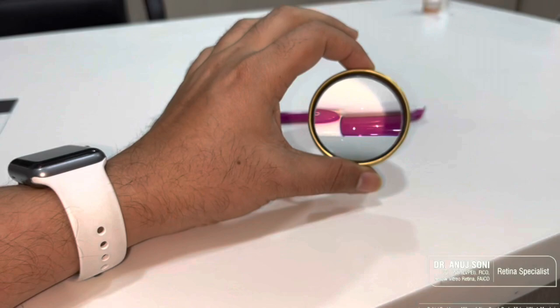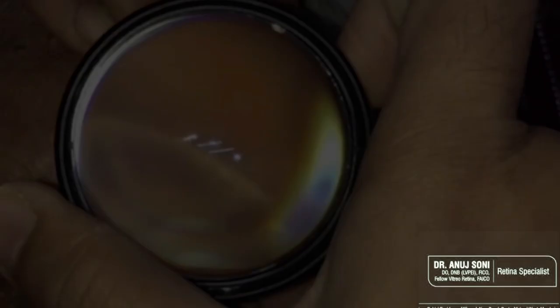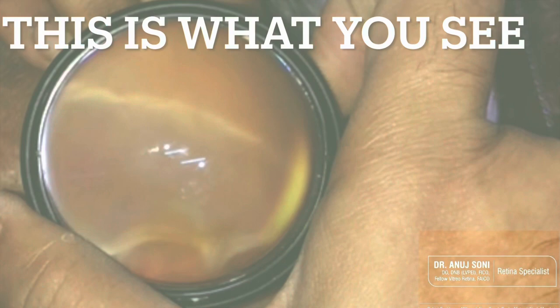We will put this into practice and understand what happens if we see the superior periphery. When the patient looks up, we are examining the superior periphery and this is what we see in our indirect.